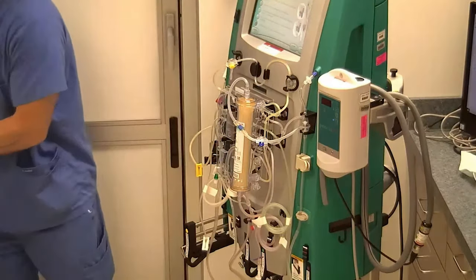Our replacement line, if that is ordered, remember that's our purple line over here, we're going to take that up to 200. We're always going to leave it where it's defaulted as a post because we want this replacement solution to hit the tubing post filter. And as you can see, the purple line empties here into our deaeration chamber.